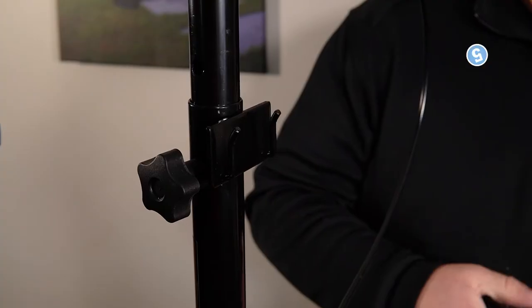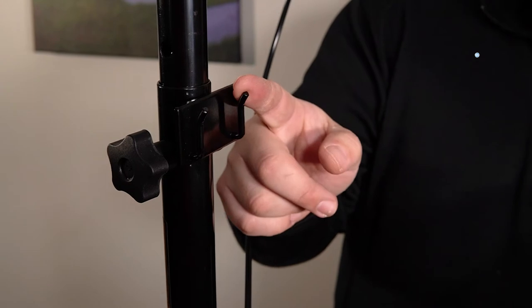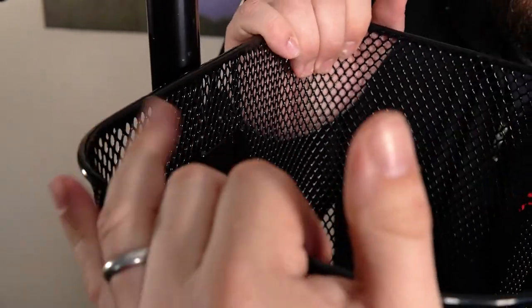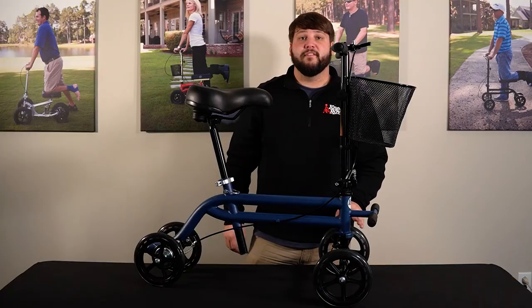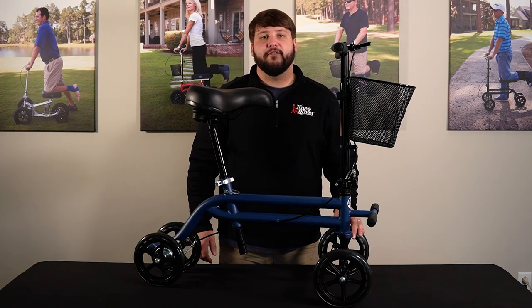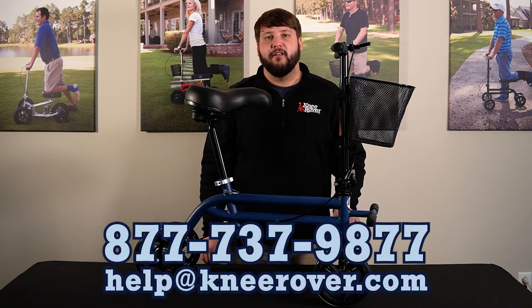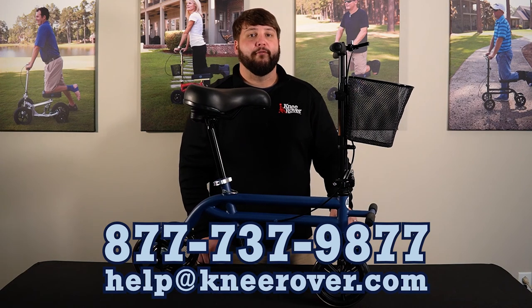Alright, so step number five, we're going to install the basket right here on this bracket. You're going to put this bracket into these little slots on the basket, put it on there like that, and then pull it down. And that concludes the assembly of our Evolution Seated Knee Scooter. If you have any questions or concerns, feel free to reach out to us at 877-737-9877, or you can email us at help@kneerover.com. Thanks for choosing Knee Rover.